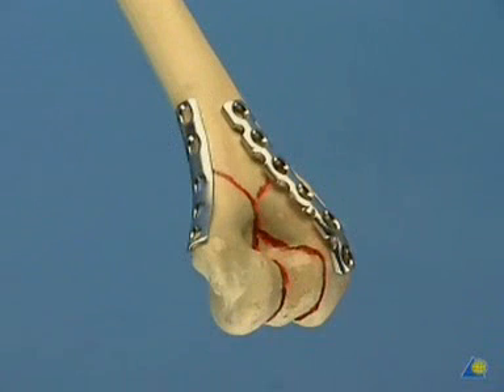For the final fixation, the plates should be placed at right angles to each other. The reconstruction plate lies on the dorsal radial side of the humerus. The one-third tubular plate acts as a buttress on the ulnar crest of the bone.